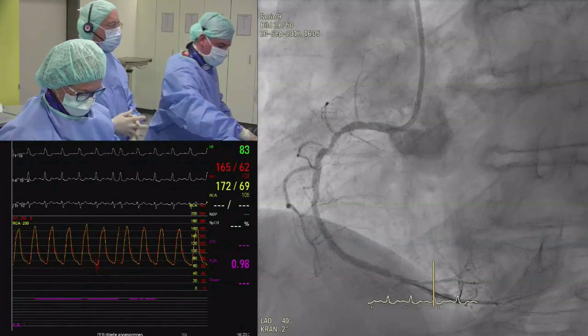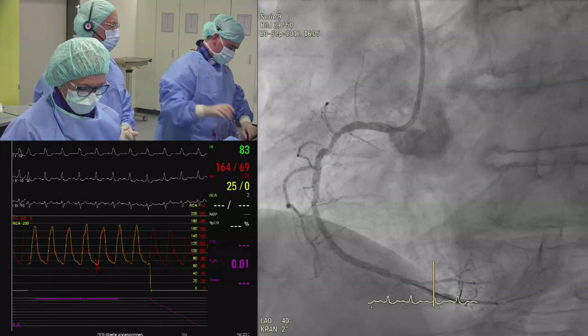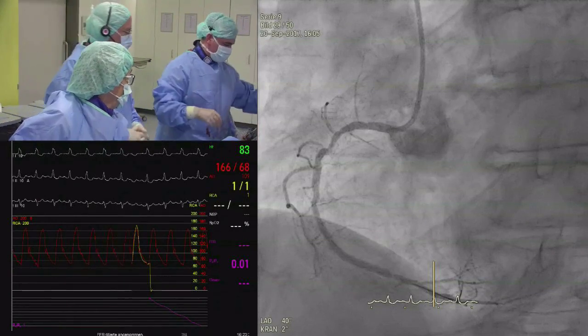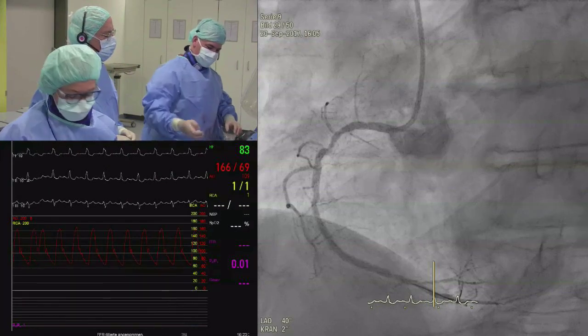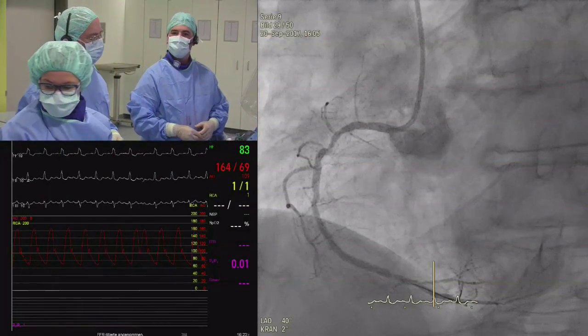By the way, you see how much easier it is for a surgeon to treat this patient, because he doesn't need to think about the vessels and the lesions in different vessels. He just puts on one good graft and that cures the whole thing. He doesn't have to think about which lesion is contributing how much, and this is probably why FFR in the surgical field has not gained so much acceptance as yet.